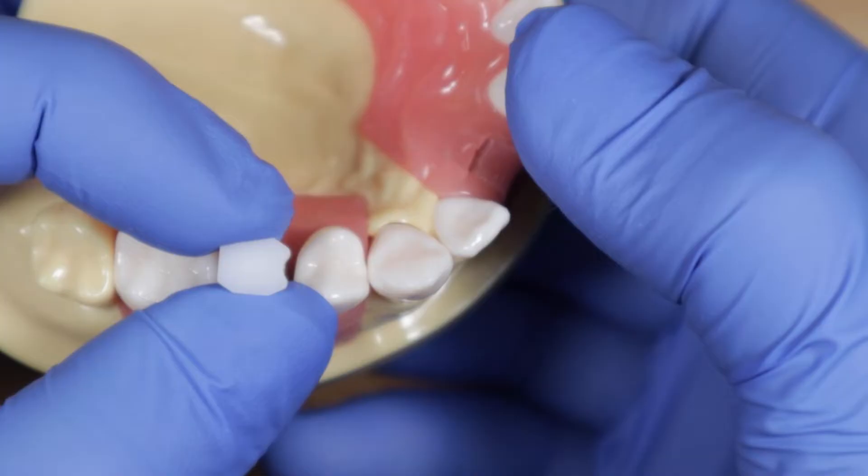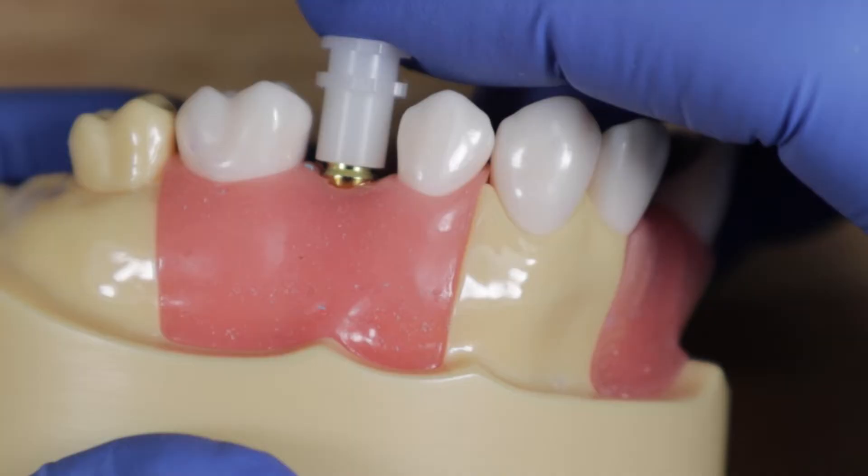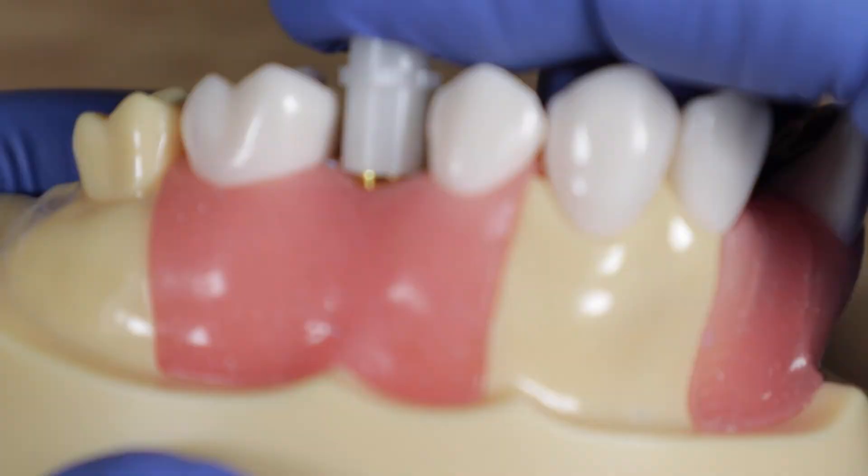Take the little white cap and put it on, remembering that the flat end is not straight mesial but mesial-buccal. Line it up, give it a push, and confirm it seats all the way down — boom, fully seated.